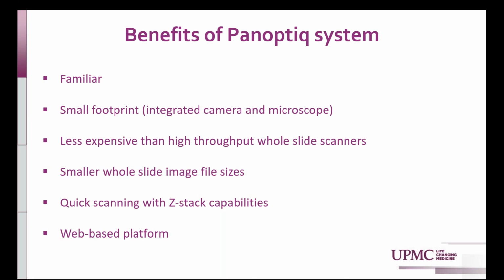So before we start discussing the clinical use cases, for anyone who may have not seen or worked with the Panoptiq system, I wanted to include a list of pros and cons so that they may have a better idea of what and how the Panoptiq system performs. The first bullet says that the system's familiar. The familiarity stems from the fact that the Panoptiq hardware comprises a small camera mounted to a microscope. All of today's pathologists, laboratory personnel, or researchers should be very familiar with their microscopes and know how to operate them. The camera exists as a digital feed to the computer where the software performs the image stitching.